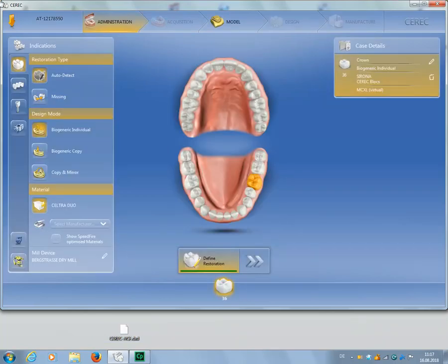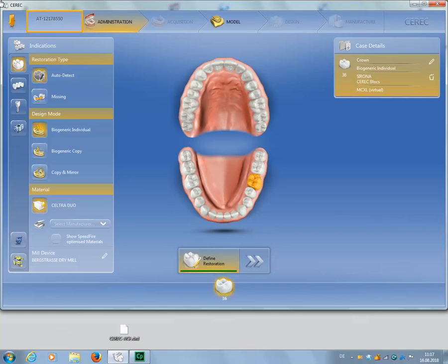Now the case is opened, but it hasn't been saved yet. The patient name of the imported CEREC file is always displayed with the abbreviation AT, followed by the case number. In the Case Details window, we check the restoration type first, then the design mode.